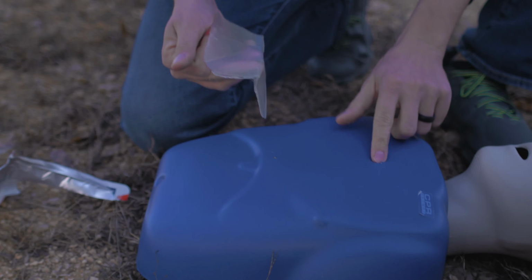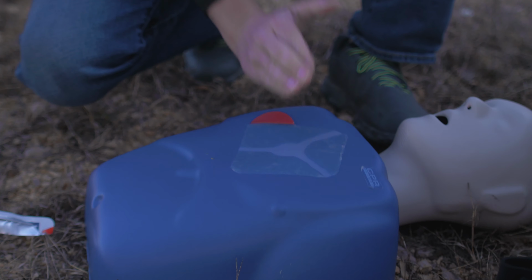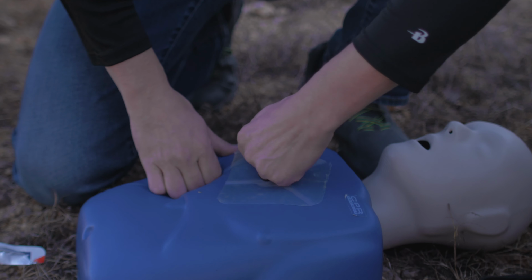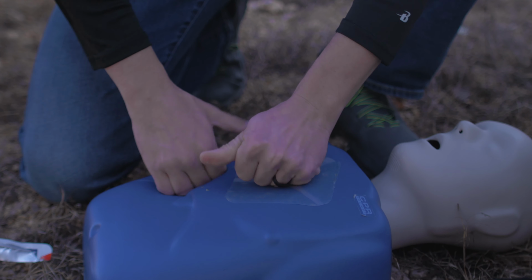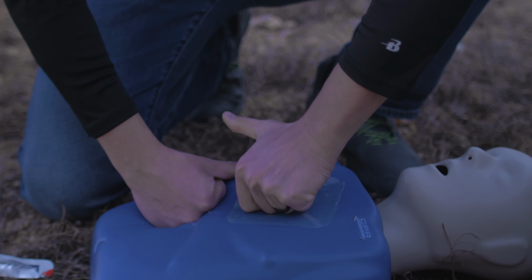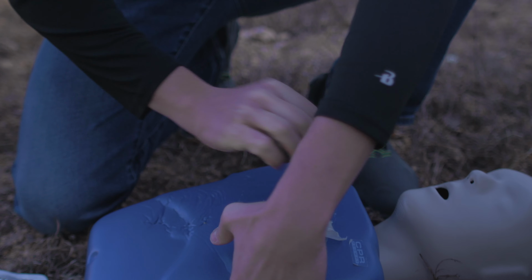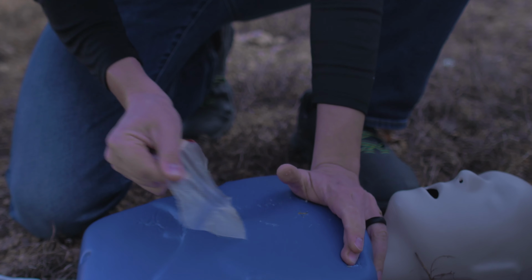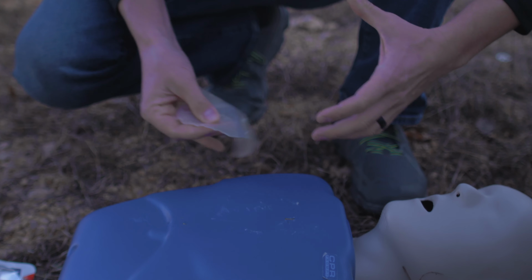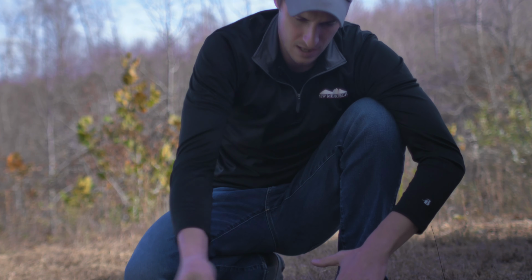Pulls right off. Put this on our wound. Slap it on. Seems to do fine. So at least one year in a hot summer plus winter, and it is currently about 45 degrees outside where we are right now too. And it's sticking just fine. And it's making a huge mess to get off. All right, it came off a little bit easier than the other one, so I don't know if that's any indication of the stickiness, but I think it stuck just fine. I wouldn't have any issues using this.